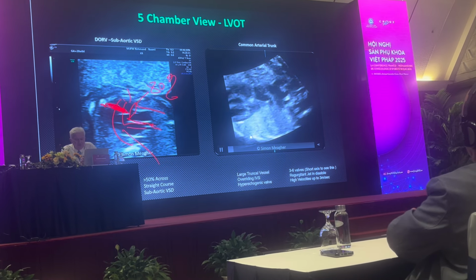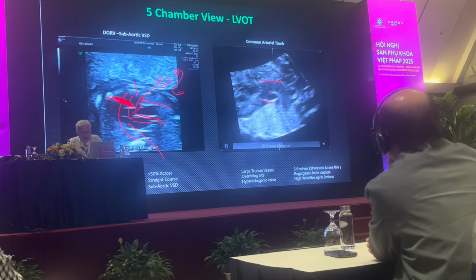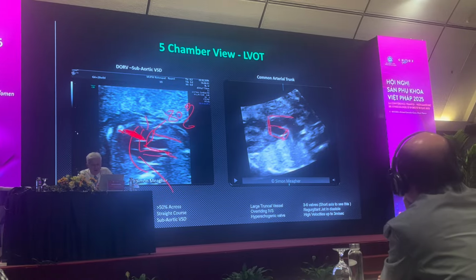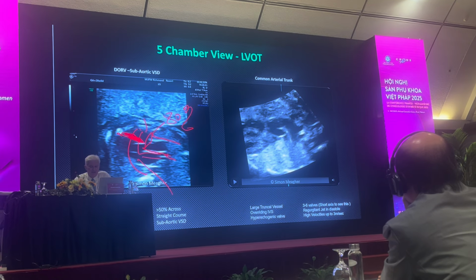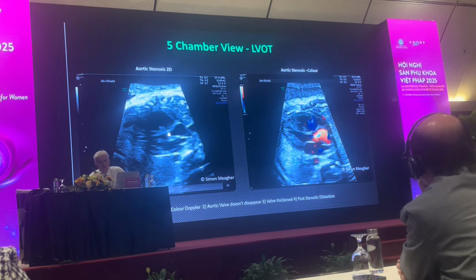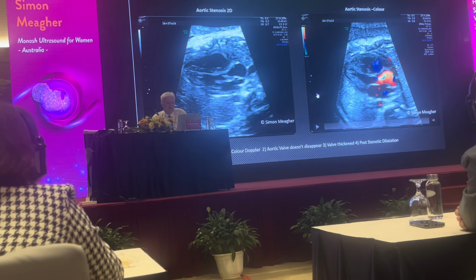This is a baby with the aortic override with a big vessel, and then it branches. This is the common arterial trunk, type 1. And this is the pulmonary artery, and this is the aorta. You appreciate this on a 5-chamber view, but again, you need to work out where the pulmonary artery is coming from. Okay, so you go to work tomorrow morning, and you see this image.